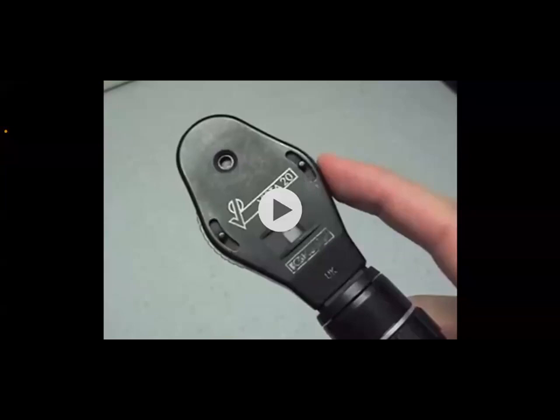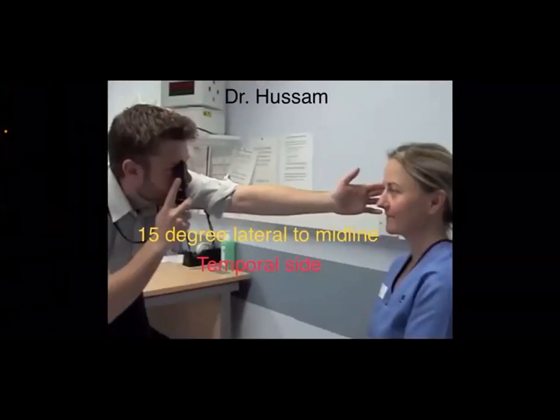Okay, how to check for the red reflex? As you can see in the picture, you will be standing 1 arm length away from the patient, and around 15 degrees away from the midline, to the temporal side, 15 degrees. You will shine the light into the patient eye, and you should look through the ophthalmoscope.